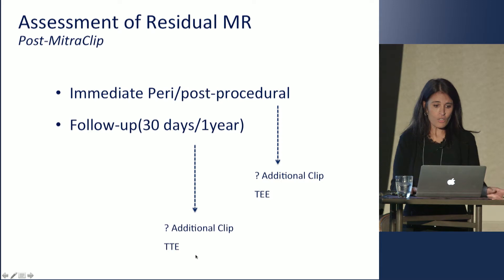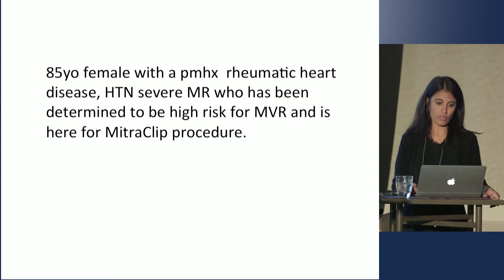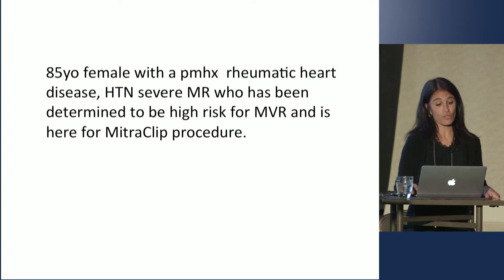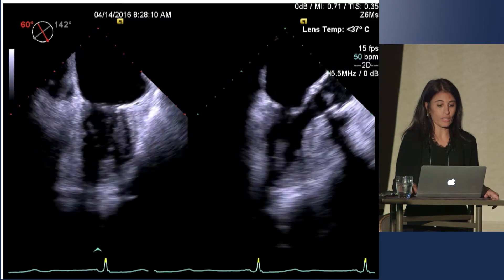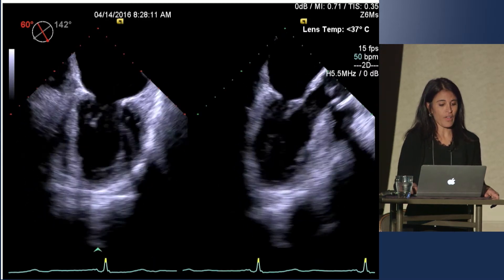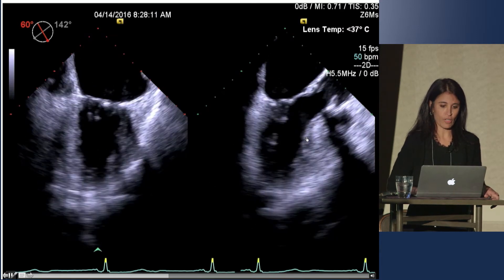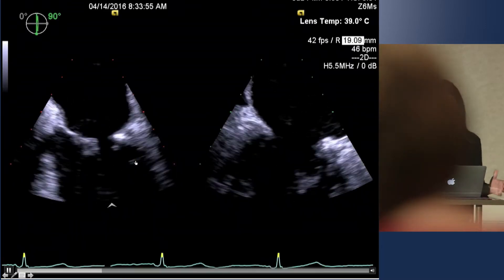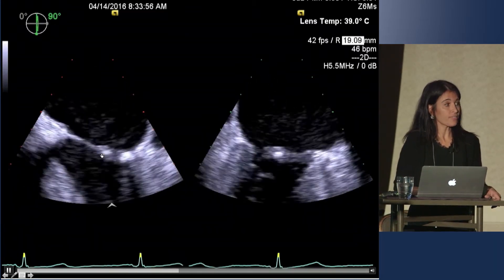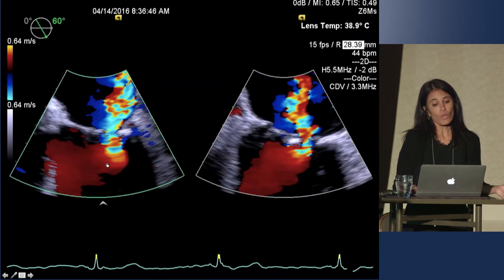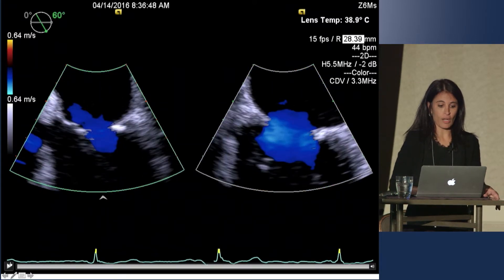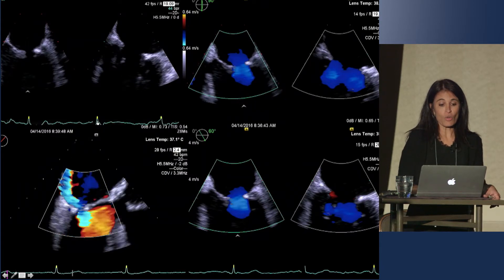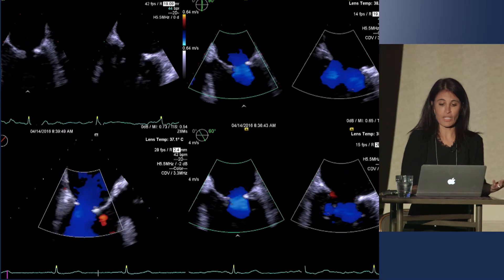A typical patient: 85-year-old, history of rheumatic heart disease, multiple comorbidities, not a patient for mitral valve surgery. So we took her to the lab. I'm going to go through our workflow when we're in the lab: LV function, mitral valve — very rheumatic appearing, anterior leaflet thickening, almost with high resolution you can see nodular thickening. In our lab we do this in a very systematic approach, going around the horn from zero to 30 to 60 degrees, with and without color, so that we can systematically review the pathology and hemodynamics and we don't miss anything.